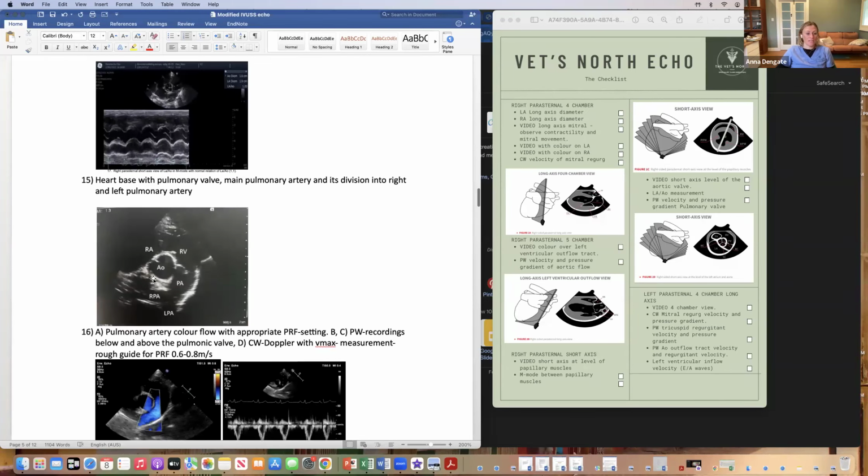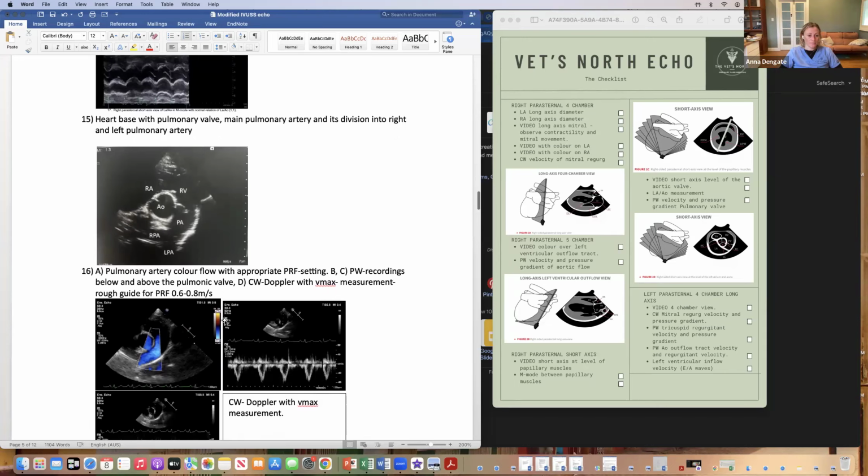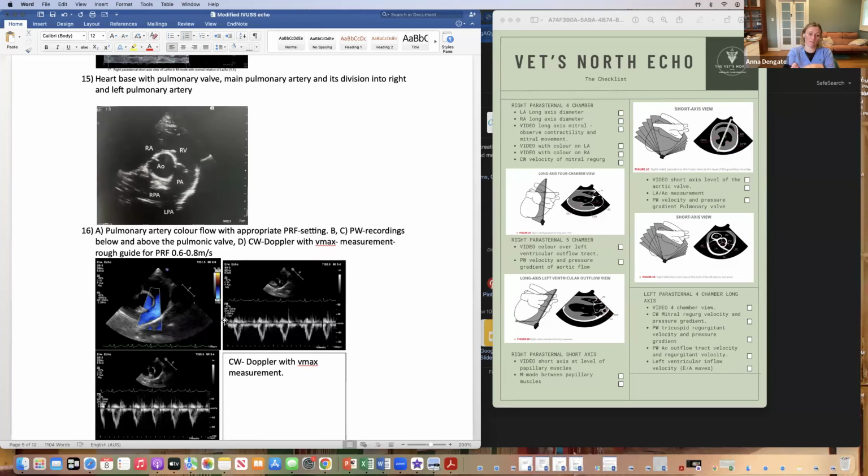So then you're still in your beautiful peace sign aorta. You've got that nice and round, and you can see the pulmonary valve, pulmonic valve, sitting right alongside it. They're right next door to each other. So then we're going to put color flow on the pulmonic valve. And again, we need to make sure we're getting subvalvular and postvalvular as well as valve. So you're going to change the size of your box to be a long sausage and sit over your pulmonic valve. And we're going to get a couple of different measurements from this position.